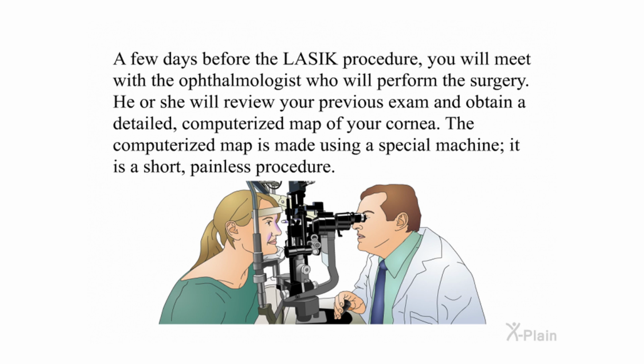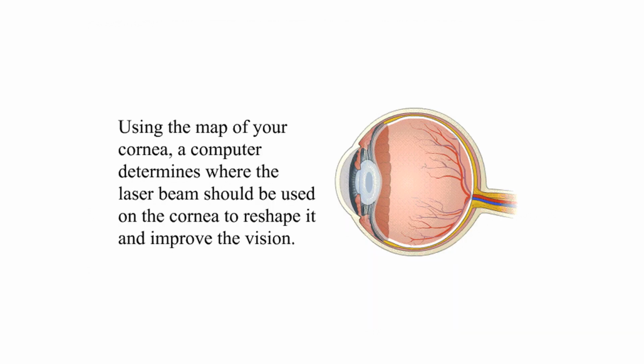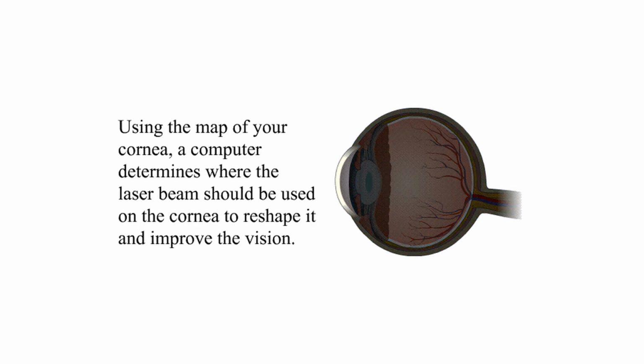He or she will review your previous exam and obtain a detailed computerized map of your cornea. The computerized map is made using a special machine. It is a short, painless procedure. Using the map of your cornea, a computer determines where the laser beam should be used on the cornea to reshape it and improve the vision.